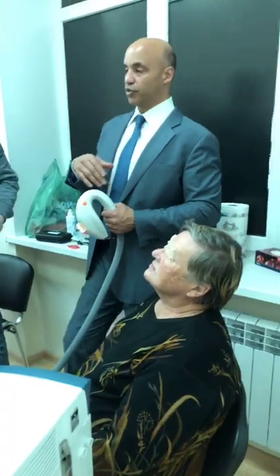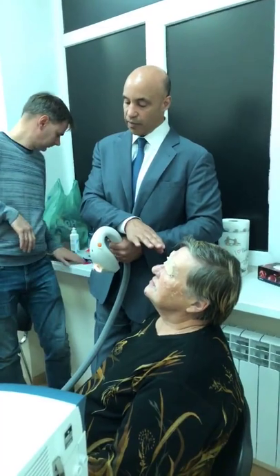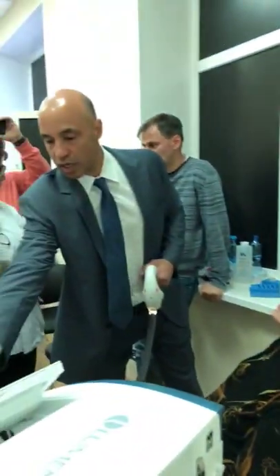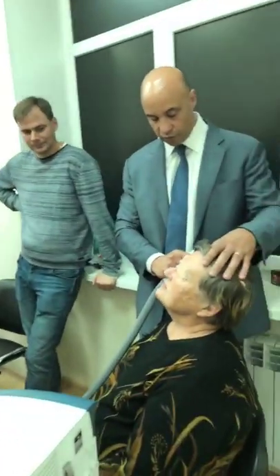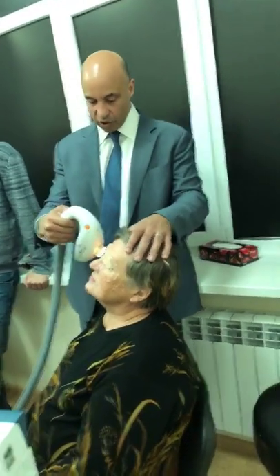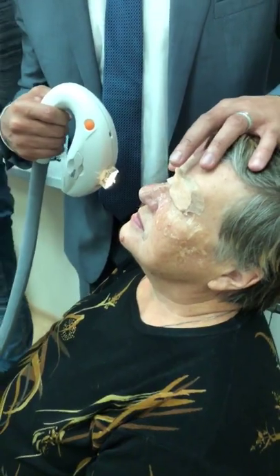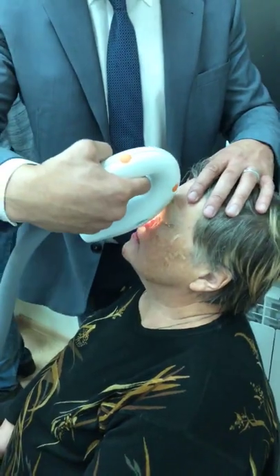So what I'm doing is, when I'm doing these treatments, I don't wear glasses. I just put the handpiece right on the skin, and then I close my eyes when I cut. All right. I've turned it off. So what I want to show you is, we're treating here, but you want to get this close to the lid margin. And as long as she's keeping that lid closed and you're not hitting the eyelashes, you're not going to have any problems. So this is what I was doing.